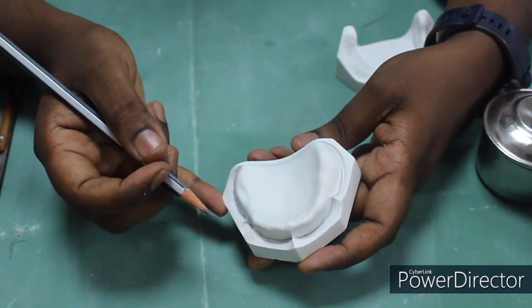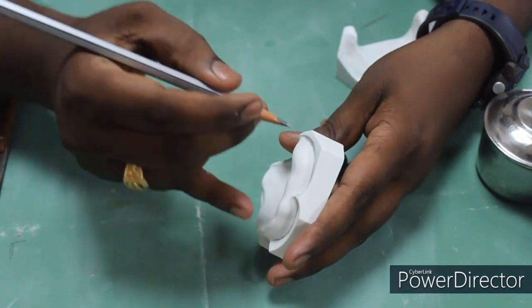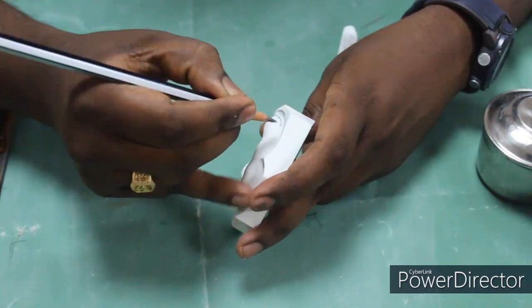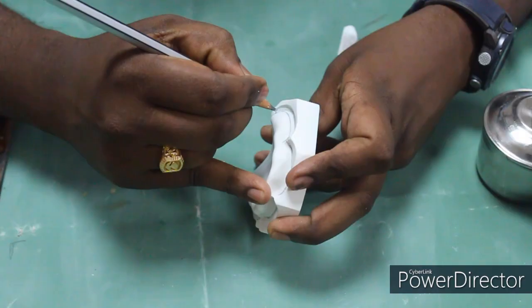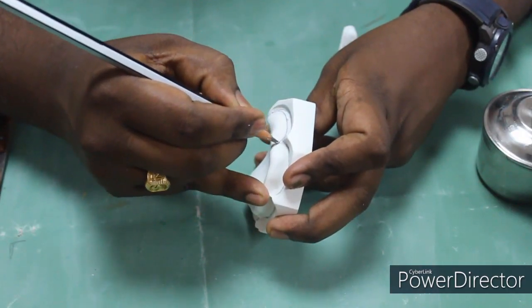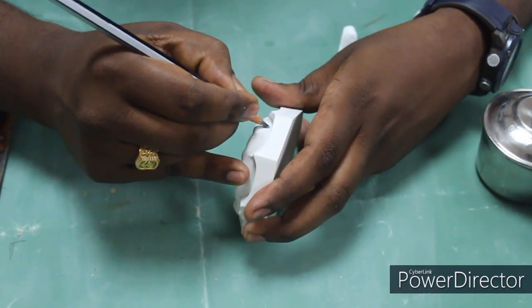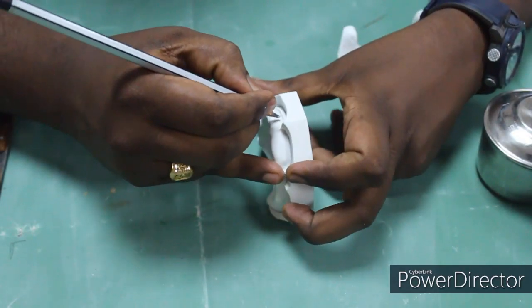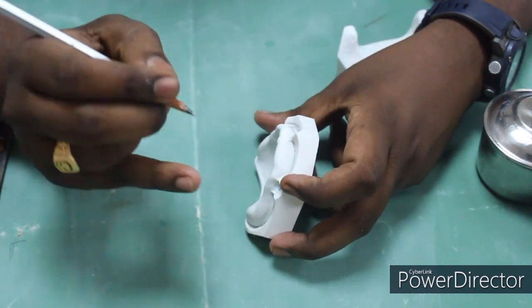And the second line I am going to draw is the tray extension. That is 2 mm from the depth of sulcus. So you will be thinking why it is 2 mm short of the depth of sulcus. The logic behind this is, you have made the primary impression and now you are going to make the custom tray for this particular clinical case. So you are going to record the peripheral borders accurately.